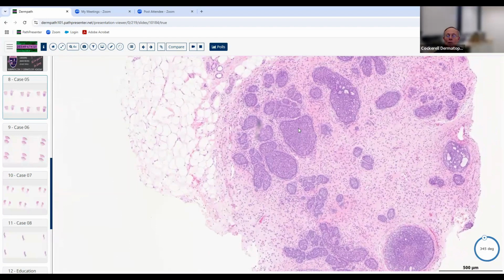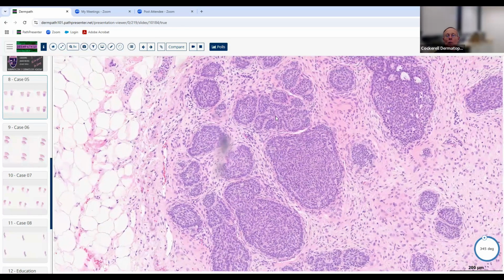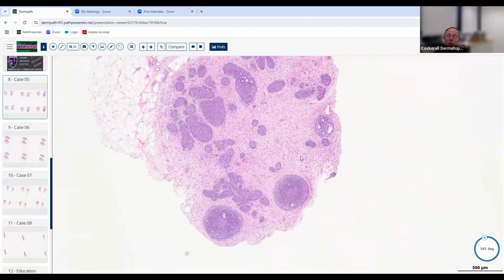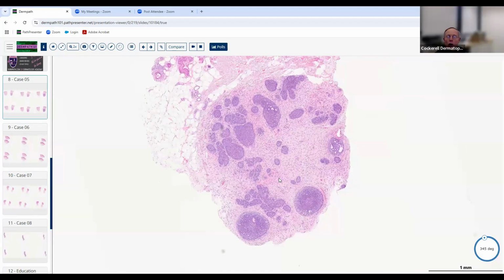And sometimes when you're looking at one of these individual lesions like this, you say, let's look at the individual. Is this one little nodule small and well circumscribed? If there's a cleft, it's going on between the stroma, right? Okay. So what's the diagnosis here? So I was thinking more of like a trichoblastoma. Yeah, trichoblastoma. So what is a trichoblastoma?